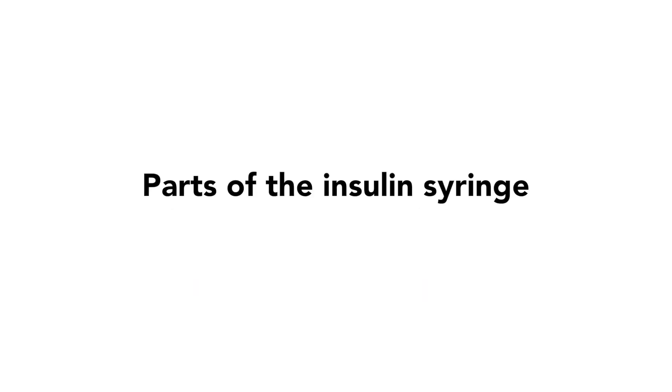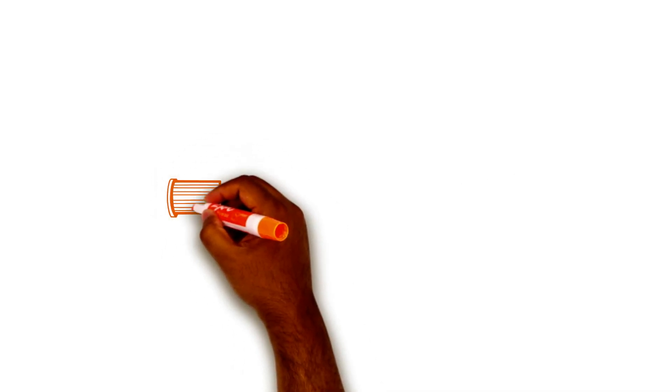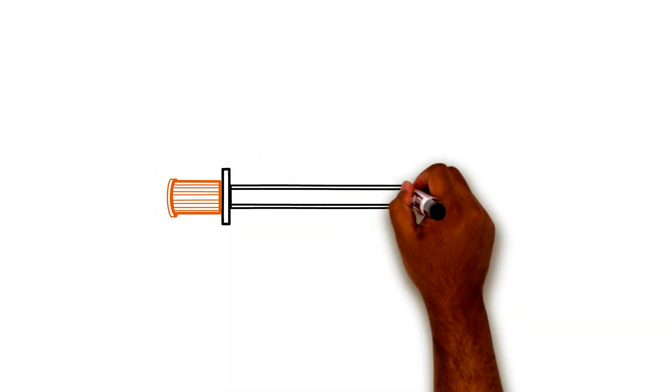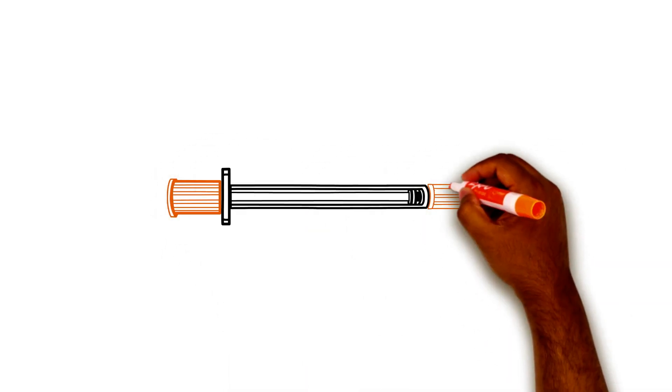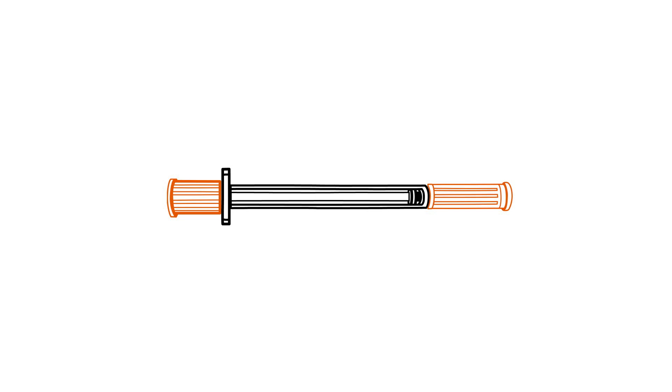First, let's look at the parts of the insulin syringe. Insulin must be given with a special syringe. They come in different brands and sizes. Your diabetes team will tell you which size is right for your child. All syringes have the same basic parts.